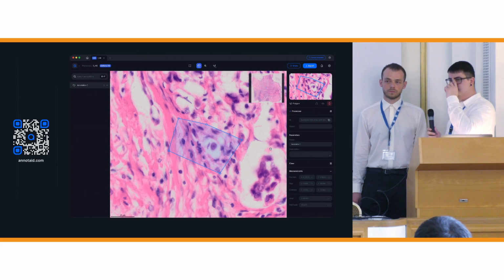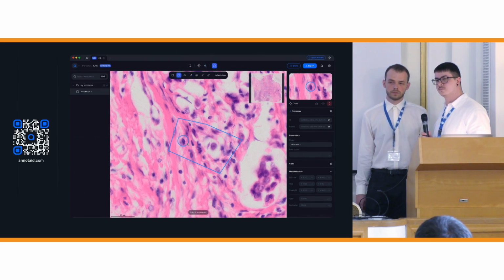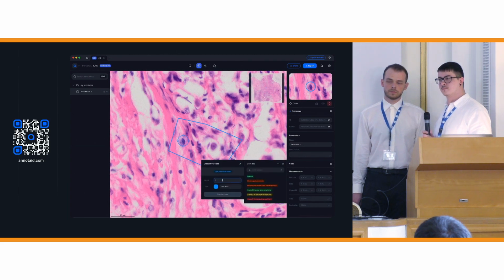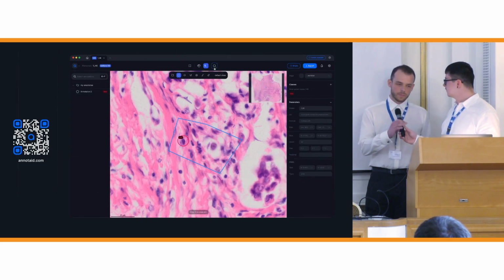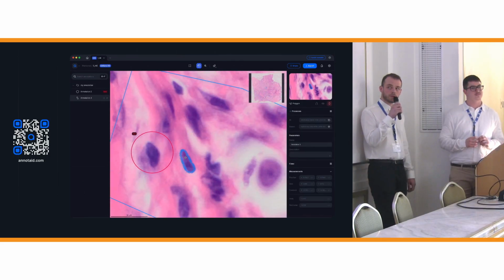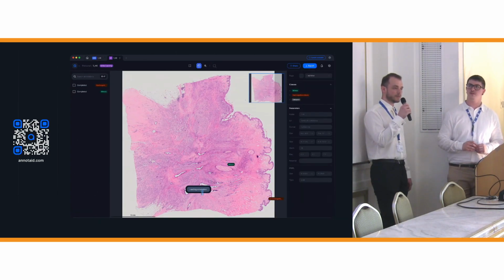Thanks. I have one more question. If you collect this data, do you check for consistency amongst the annotators? For instance, whether somebody is maybe doing the wrong job, like they are not good enough at this. Is there some mechanism to check for consistency between the different annotators to make sure that the data has high enough quality? We show the same annotations to all users, and then we decide the final label by using majority voting. The testing session was done very recently, so we don't know the results yet.